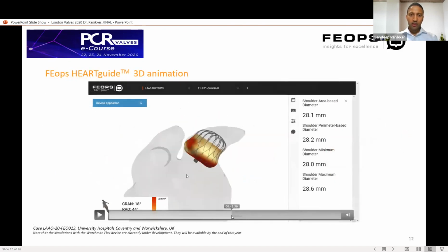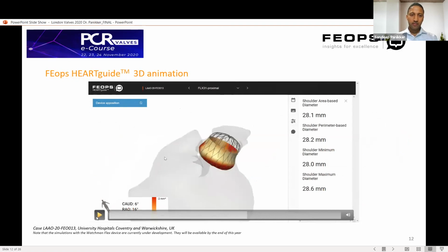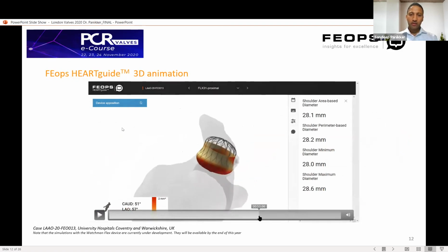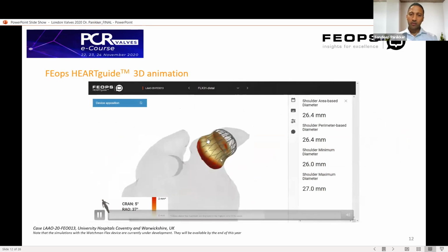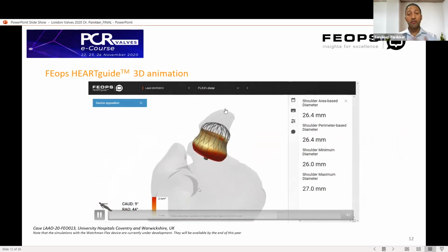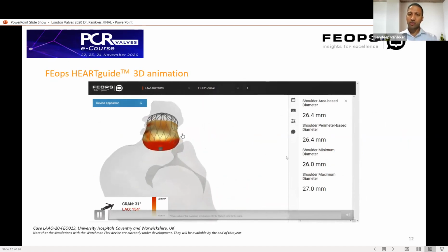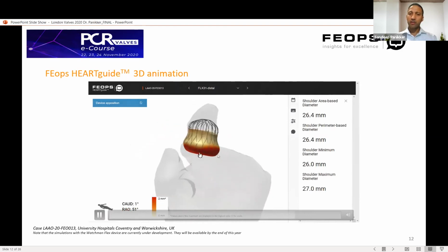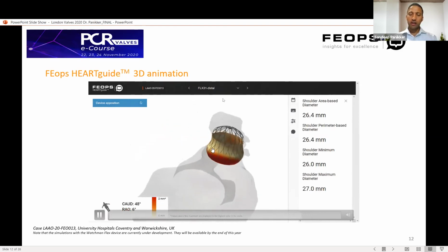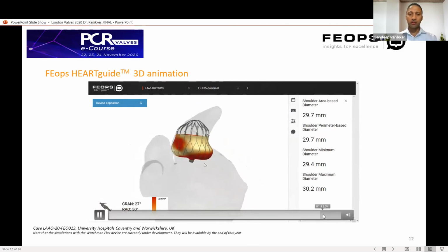So the distal position will be coming up here. So the distal position is here, and what you can see is that that pouch is now uncovered. So this would not be an optimal position for me, but for other reasons, if there was no pouch there, it would be great. For those of us who do implants, we know that covering the whole Coumadin ridge is not necessary because it's relatively smooth and thrombus does not tend to form there. But with such a sizable pouch, I thought it would be important to cover it.